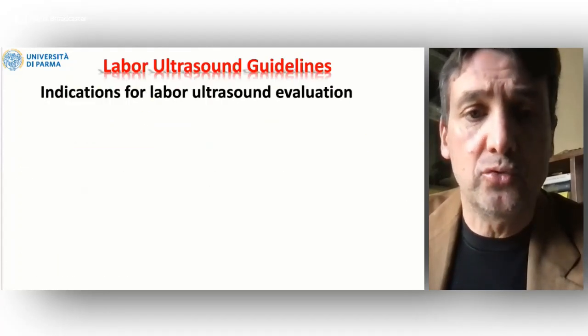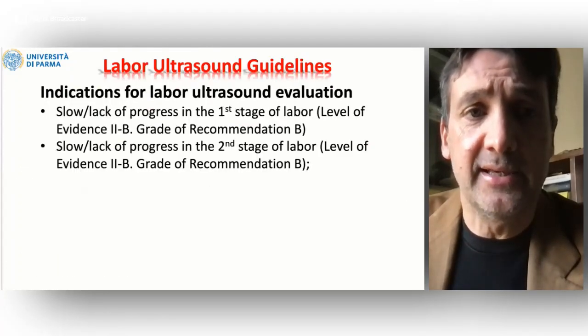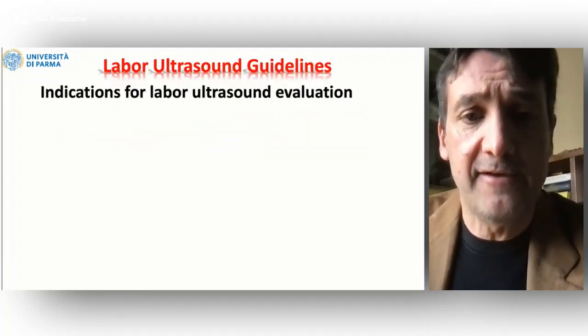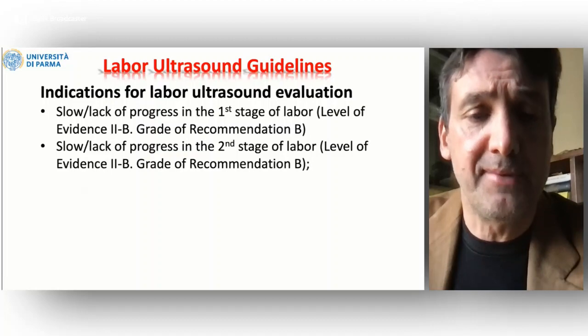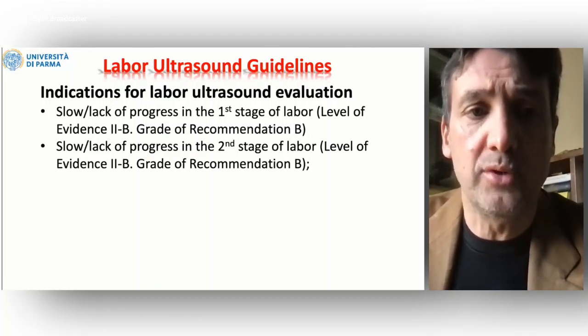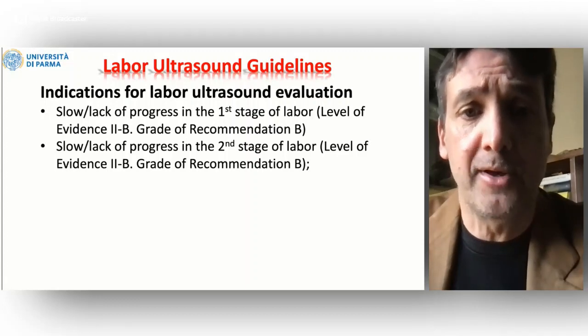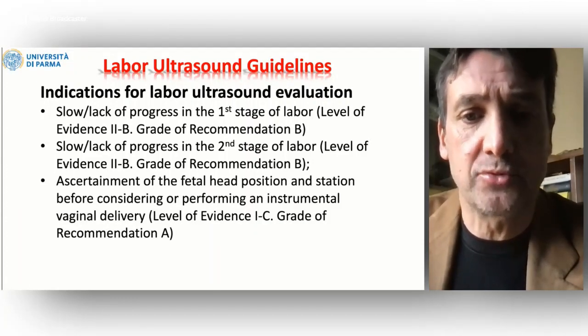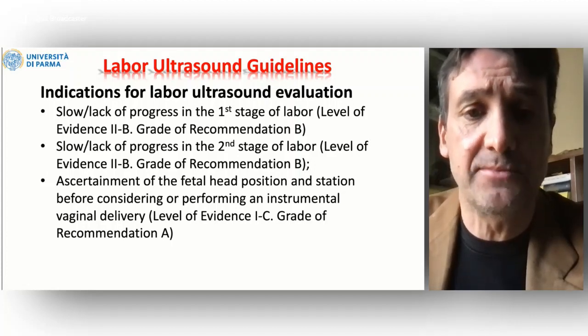Due to this awareness, ISUOG guidelines, which have been quoted by Dr. Youssef, have endorsed the use of intrapartum ultrasound for both indications: women with a prolonged first stage of labor, but also second stage of labor, and women that are about to be submitted to instrumental vaginal delivery, in order to assess the fetal head position and station to decide if the instrumental vaginal delivery is feasible or not.